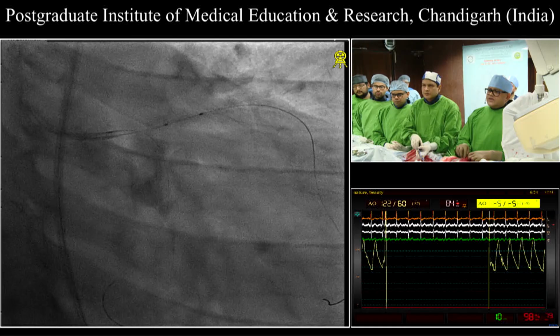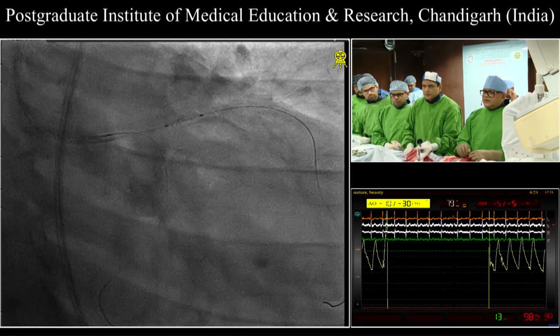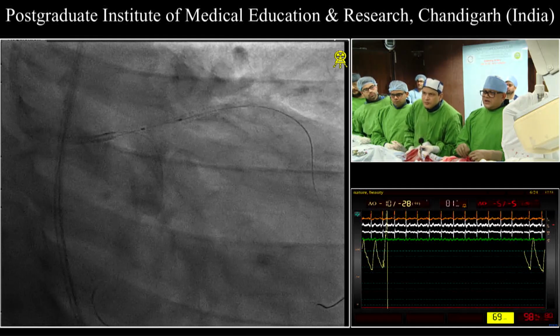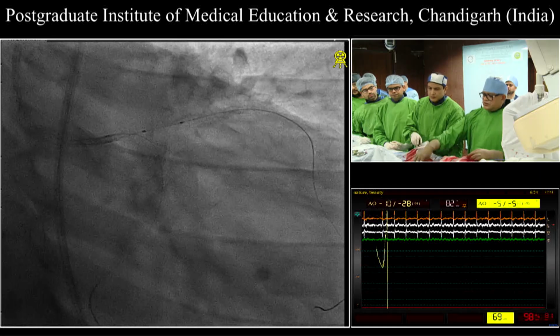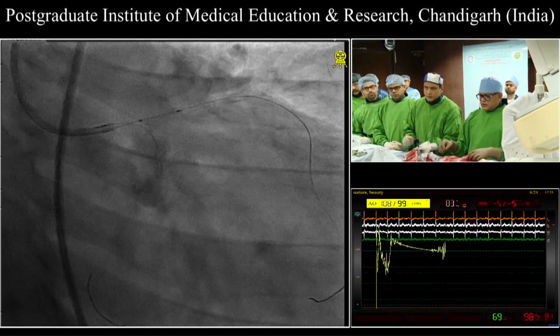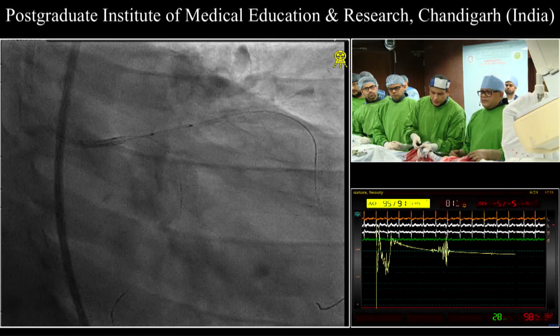Any comment on, say, cutting balloon in a fibrotic ostial LAD lesion? So we have dilated the in-stent restenosis, stented segment. Okay, go ahead, 11.